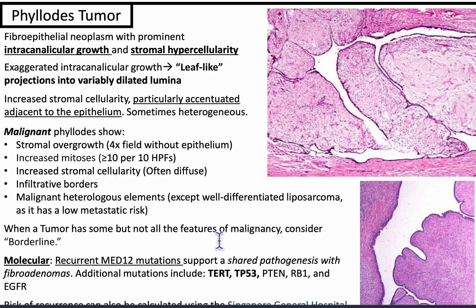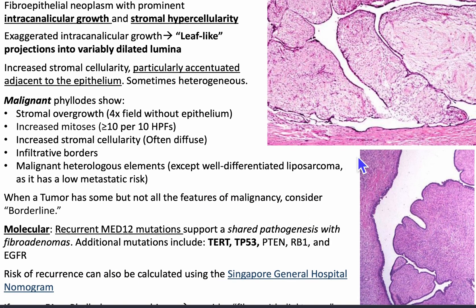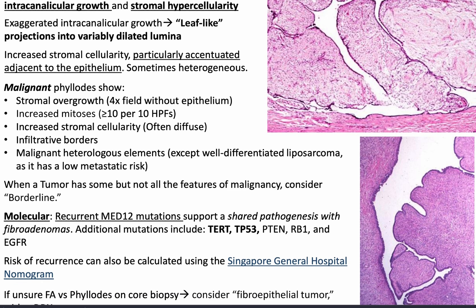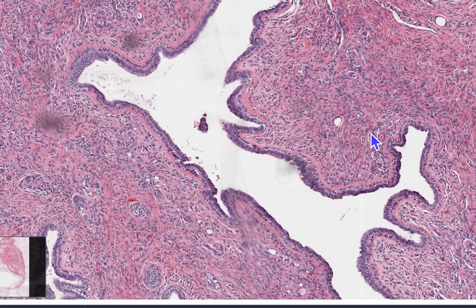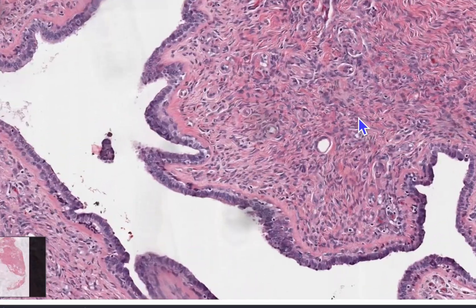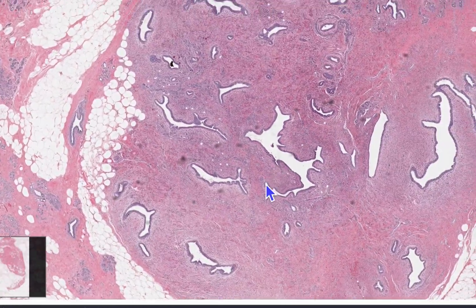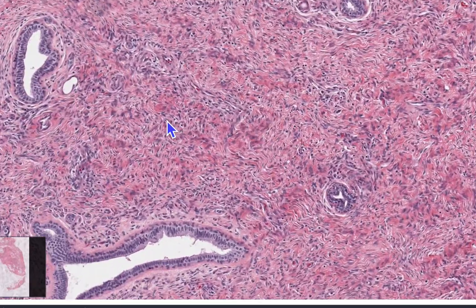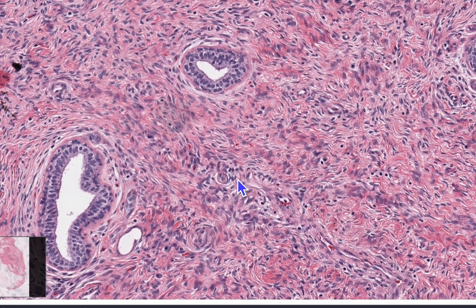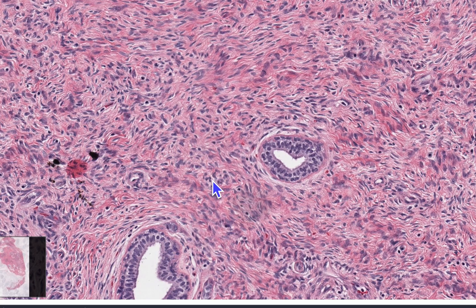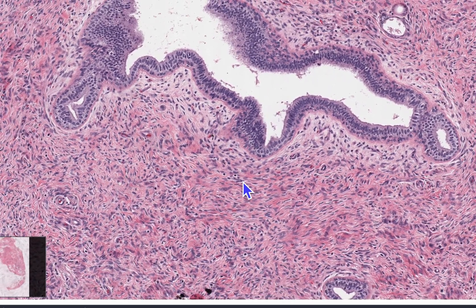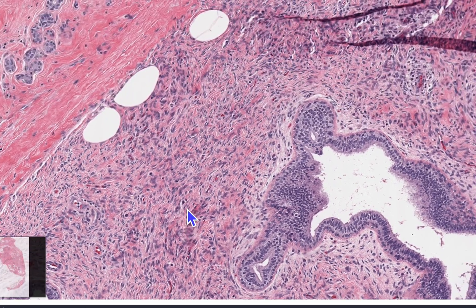When a tumor has some but not all features of malignancy — apart from malignant heterologous elements — consider borderline. Molecularly, there are recurrent MED12 mutations, supporting a shared pathogenesis with fibroadenomas. Additional mutations include TERT, TP53, PTEN, retinoblastoma 1, and EGFR. This case of phylloides tumor doesn't necessarily have great leaf-like architecture, but you can appreciate the stromal cellularity. The mitoses per high power field were fewer than five, so this is likely benign or borderline.